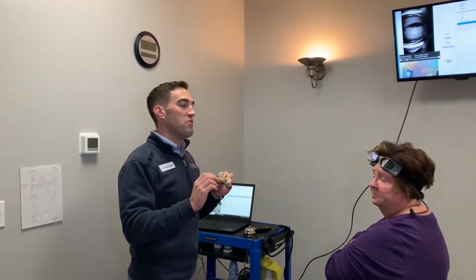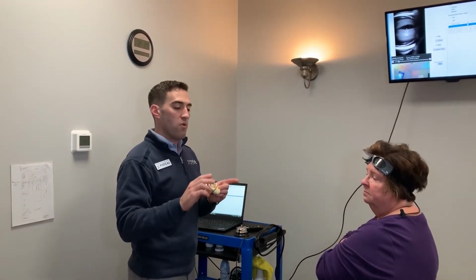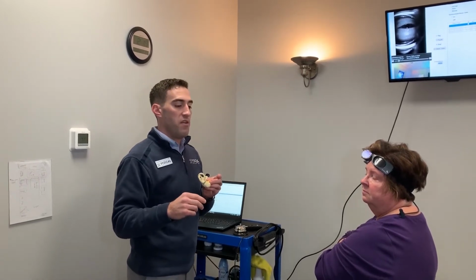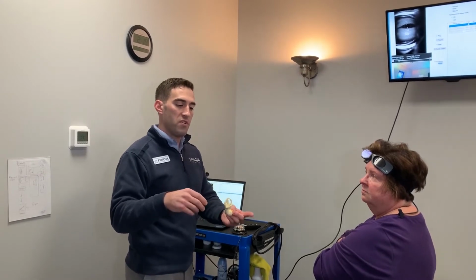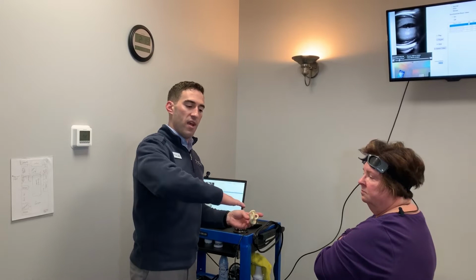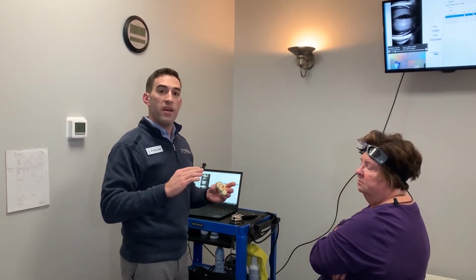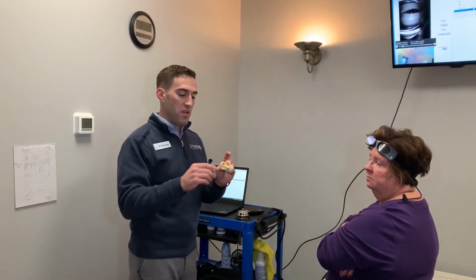So what we want to do today is look to see to the right hand side, it was the worst side, where she has the vertigo, and we'll see her eyes beat in a certain direction. And we'll also check it out on the left hand side, but we're going to do a little maneuver to the left hand side first. So I'm going to have her sit up. We have this special table that reclines so it doesn't put her neck in a real awkward position. And then what we'll do is go through what's called an Epley maneuver to help get these crystals back where they belong in this little chamber.